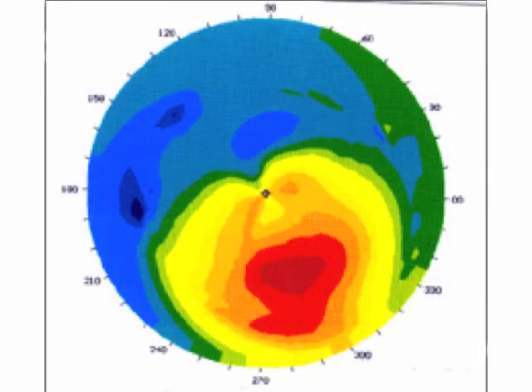Okie doke. So what is a keratometer not going to tell us? Well, it's not going to tell us about a cornea like this, because the keratometer really only gives us two sets of readings.